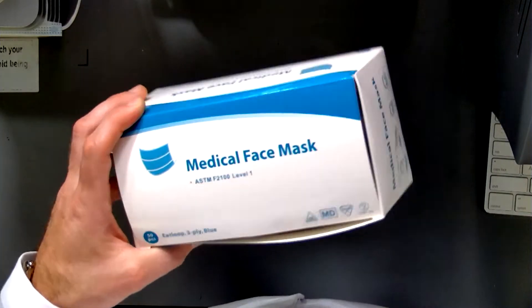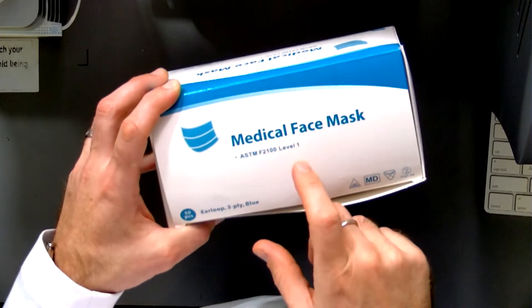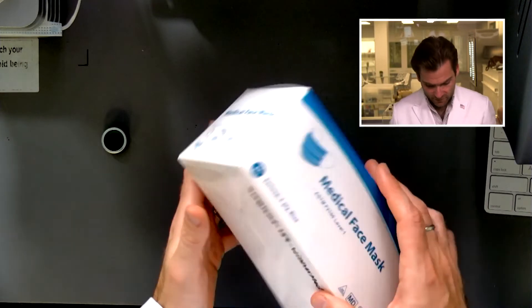They are claiming F2100 ASTM Level 1 right there. If only someone here had a machine capable of doing that — oh hi, it's me. All right, let's open this guy up and check it out.